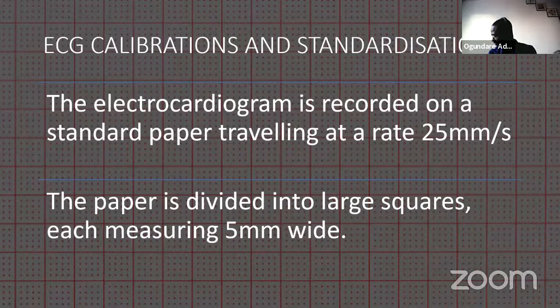Thank you, nursing vlog. You can include that as part of the standardization for ECG. So for a standard ECG speed, that will cover 5 large boxes in a second.